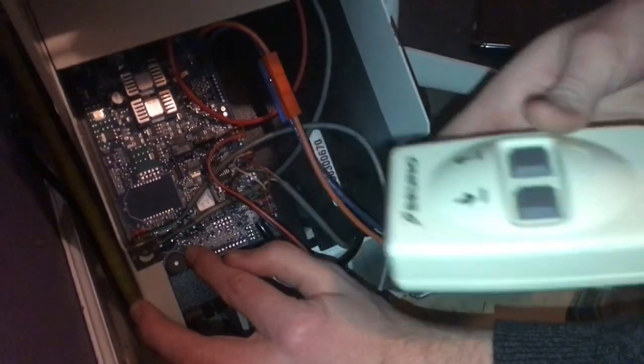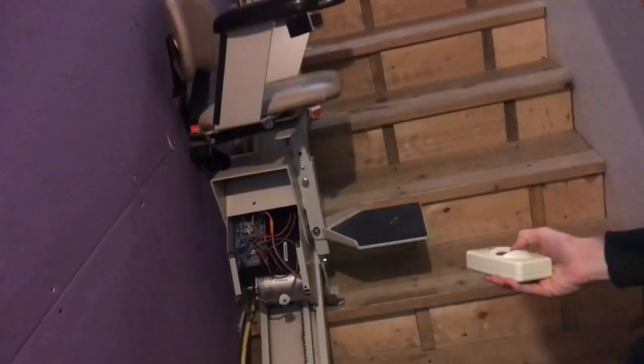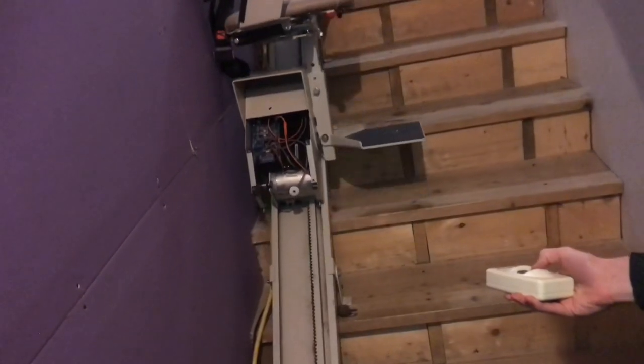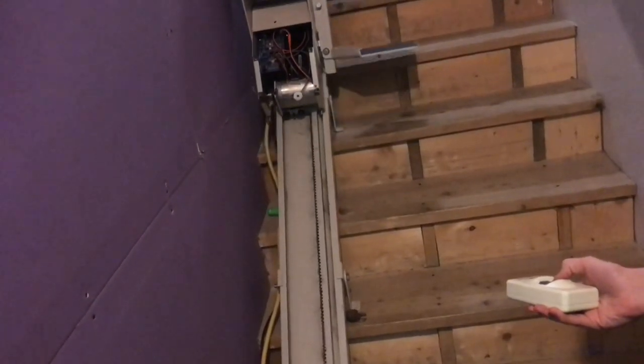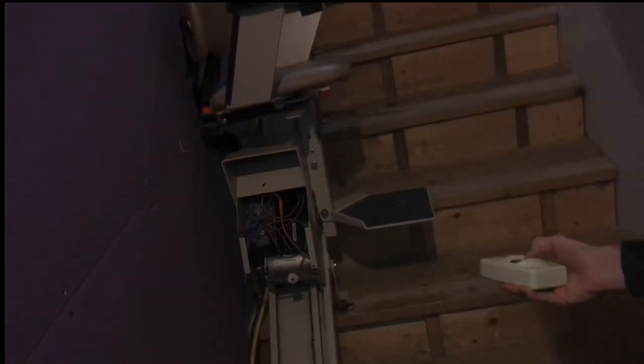The chair itself can be moved up with the remotes, or there's a button on the chair. We'll run everything up and down to make sure that it's not too close to the wall. Once the distance is verified, we can bolt everything down to the steps. Now you're ready to go up and down the steps.